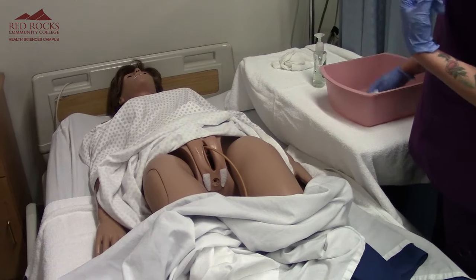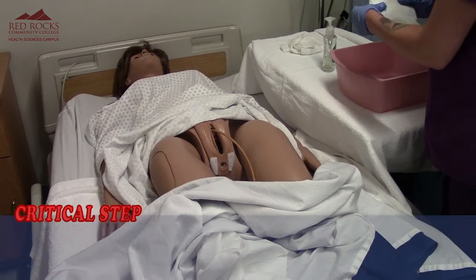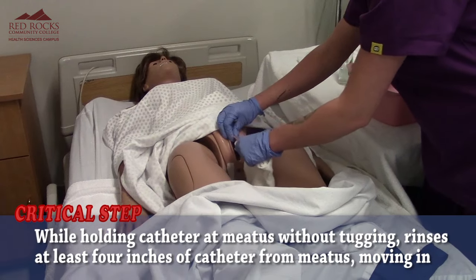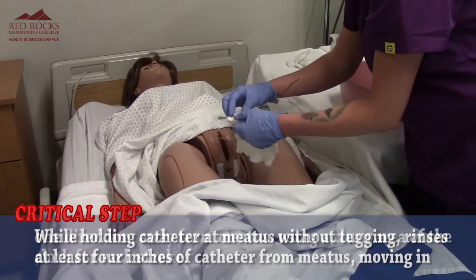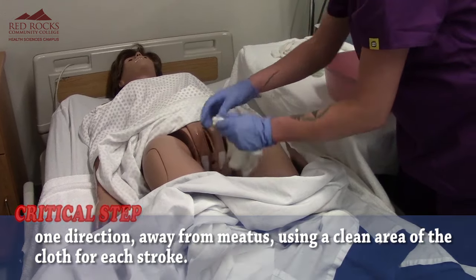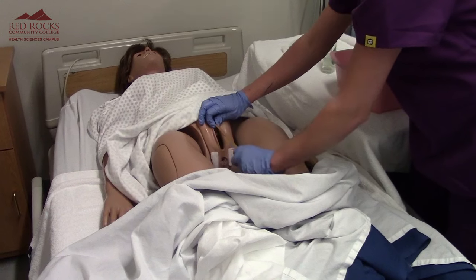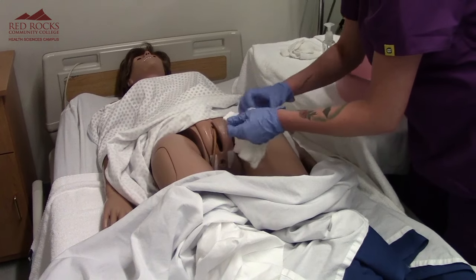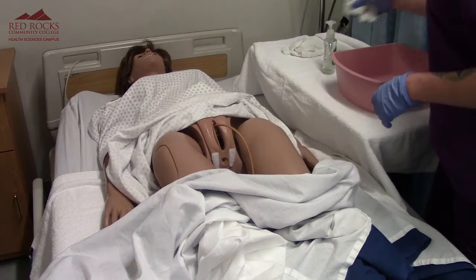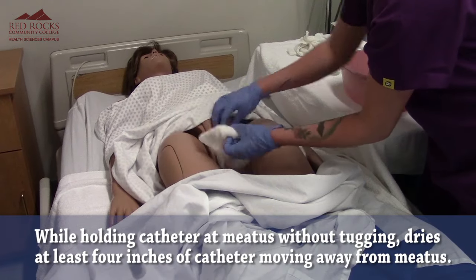Now I'm going to get my rinse washcloth ready and do the same thing, rinsing the catheter while holding at the meatus and not tugging. And now I'm going to dry her off using this washcloth.